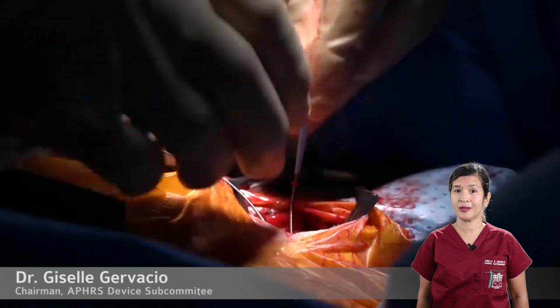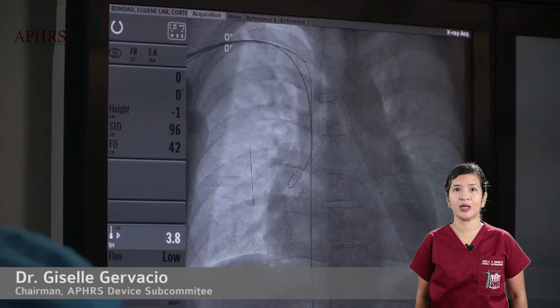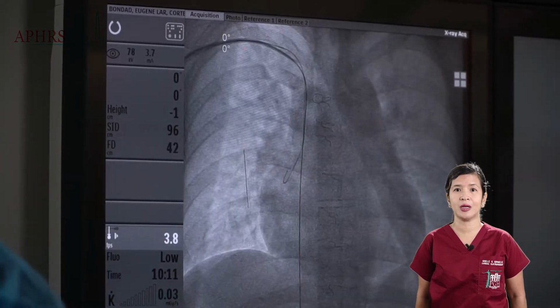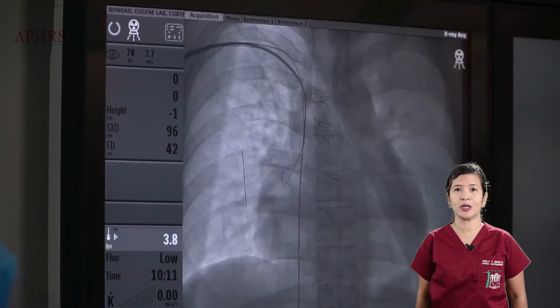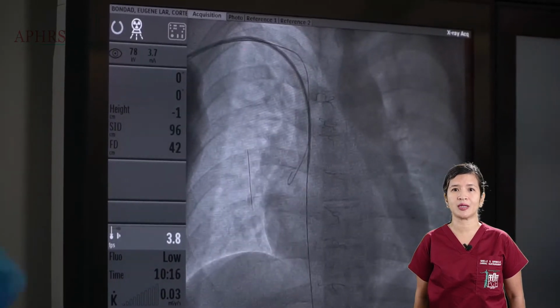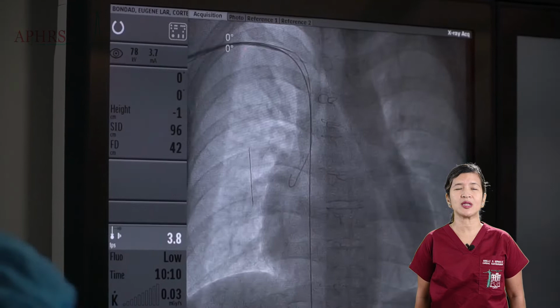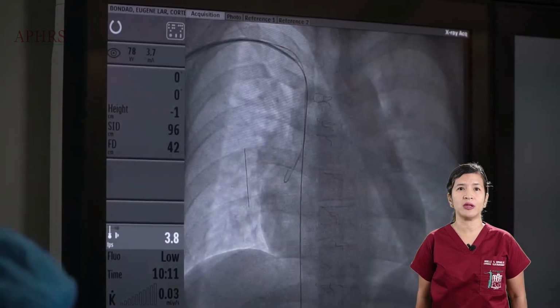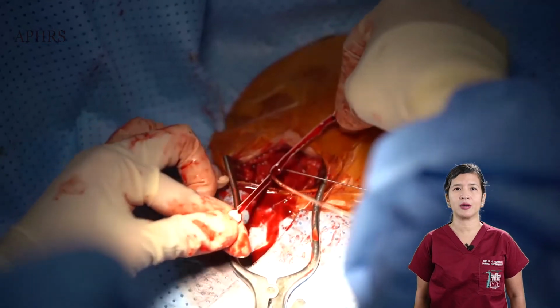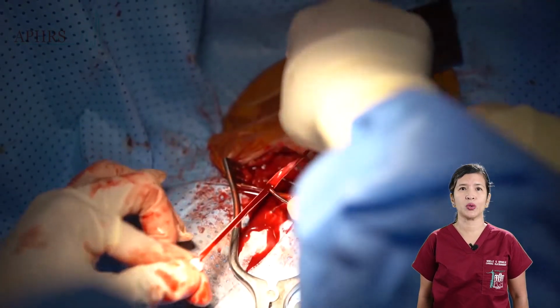The peel-away sheath is inserted over the guide wire, with the guide wire positioned in the inferior vena cava. This is done under fluoroscopy to ensure that no part of the vein or heart wall is snagged. The lead is then physically inserted through the sheath, positioned in the inferior vena cava, and the peel-away sheath is removed as shown.